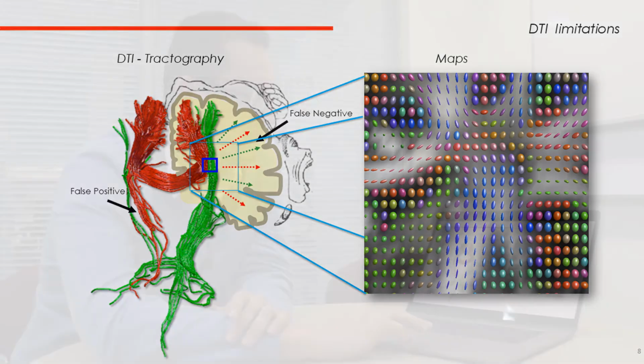So we can see something about the corpus callosum here, corticospinal tract, but not much. So what we really want is to look in more detail at what we don't see here. But many people were asking, do we really need advanced models? So how bad is it?